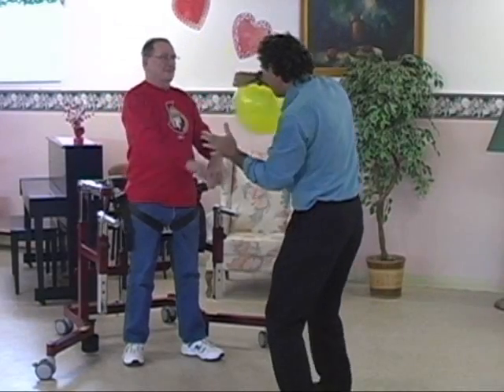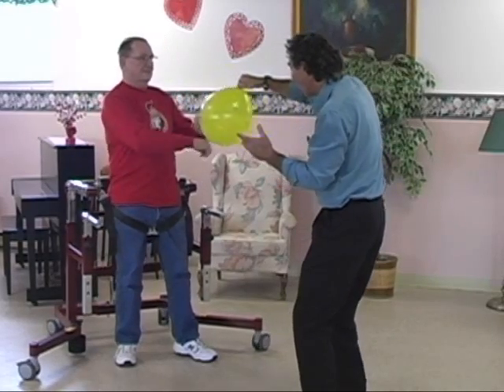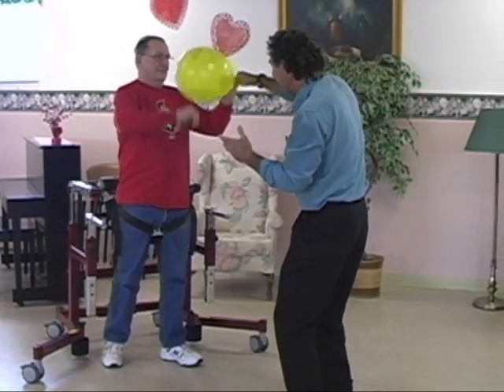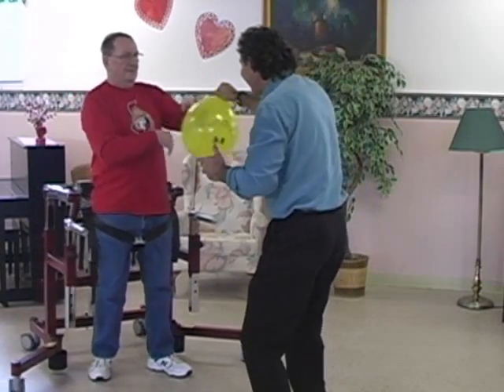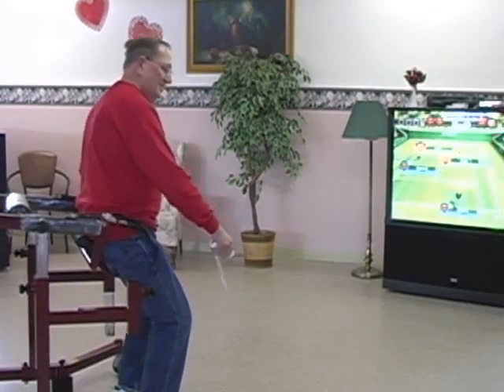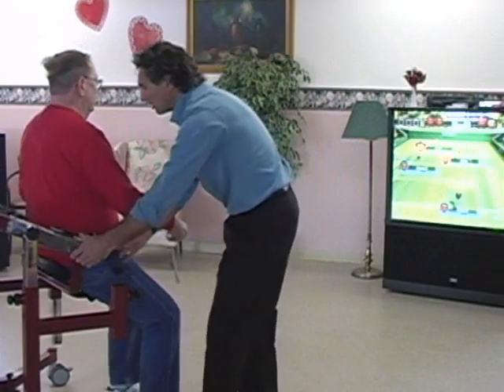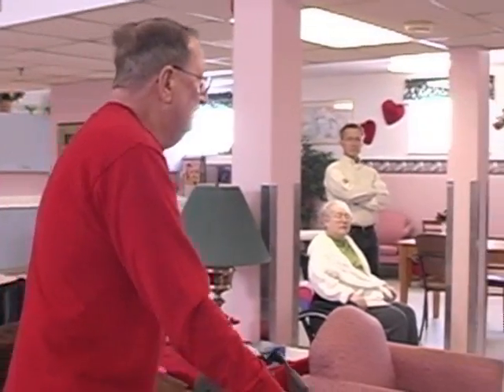With the new MDS originated emphasis on mobility training, the Bungie Mobility Trainer is fast becoming an effective yet simple to operate tool that requires only a single support worker and offers a safe environment for training of moderate or high level mobility for people who have potential for increased independence.